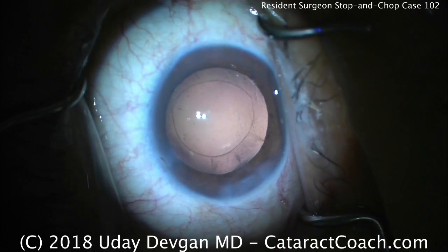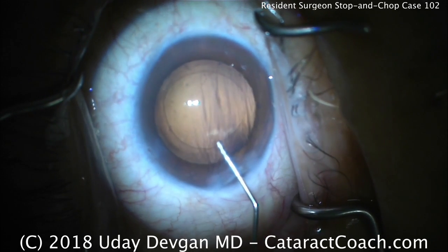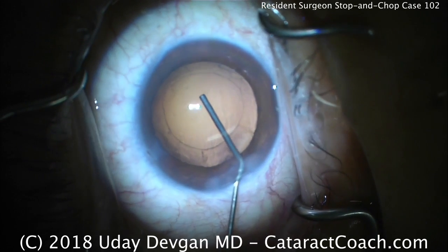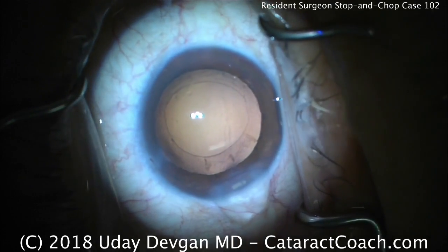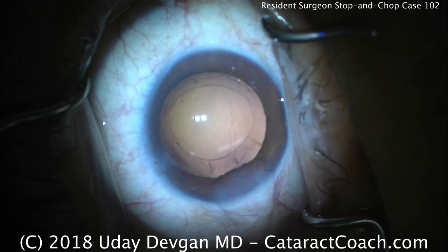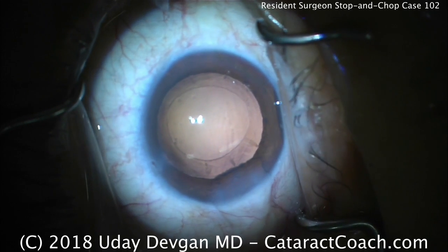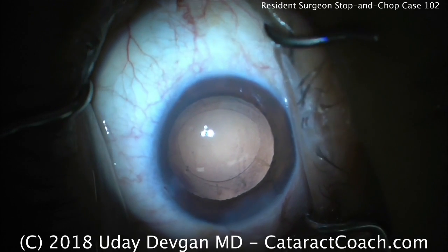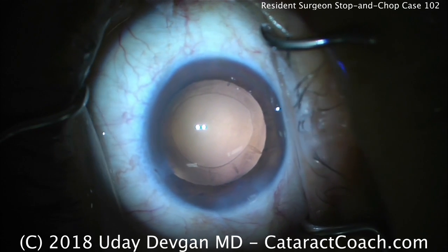Time to fill the eye with viscoelastic — we want a cohesive viscoelastic here; fill the capsular bag nice and deep. We're going to load up a single-piece acrylic monofocal lens. For county hospital patients we mostly put in monofocal IOLs; very rarely a multifocal. Residents will sometimes do toric lenses for patients with higher degrees of astigmatism, but by and large our typical technique is a monofocal single-piece acrylic lens, aiming for a target between plano and about minus one.